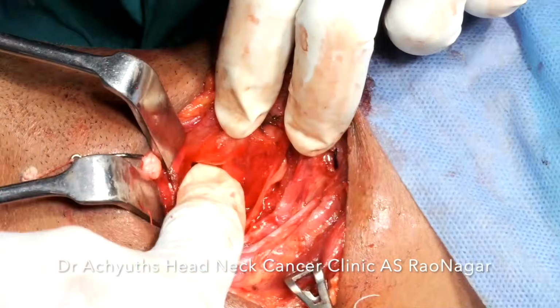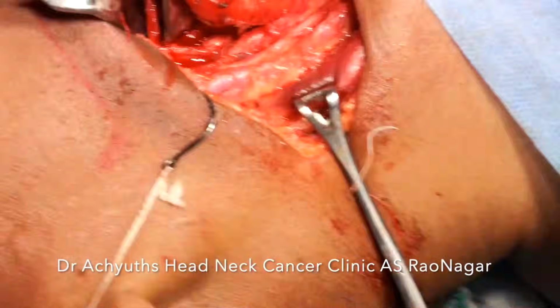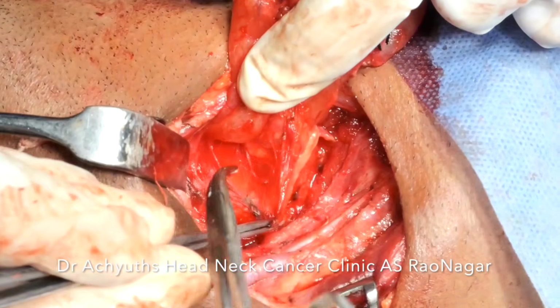Now we are working over the thyroid cartilage. We can palpate the thyroid cartilage. Yeah, that's the thyroid cartilage lamina.